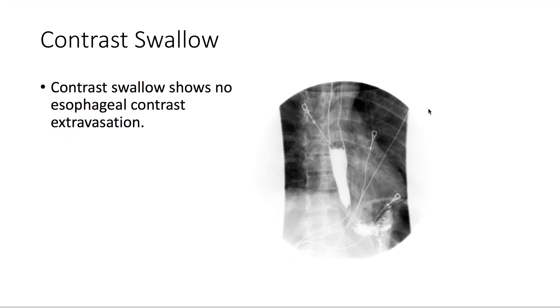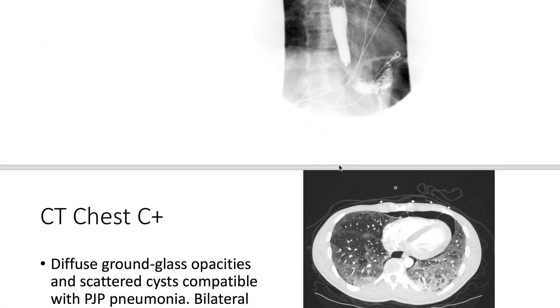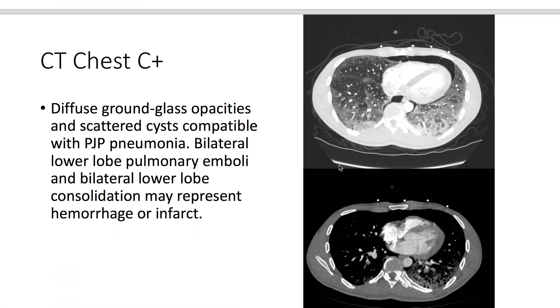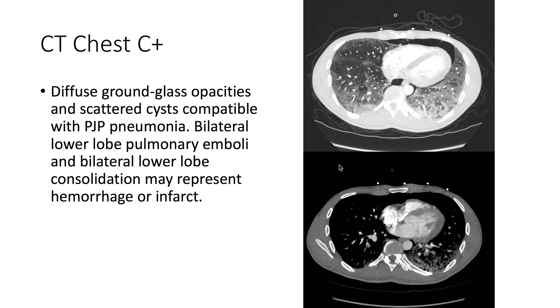Taking a look at the contrast swallow study, we note that there's no extravasation of contrast from the esophagus. Taking a look at the CT of the chest with contrast, we note that there are diffuse bilateral ground-glass opacities and scattered cysts compatible with PJP pneumonia.